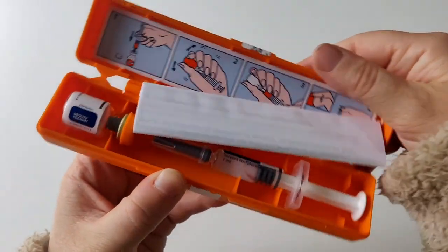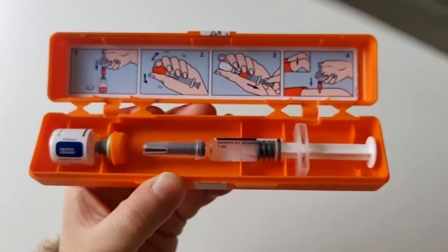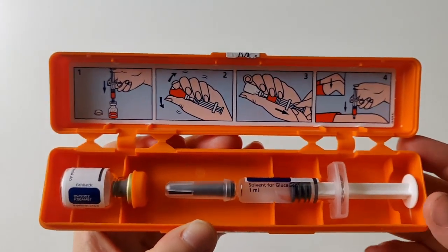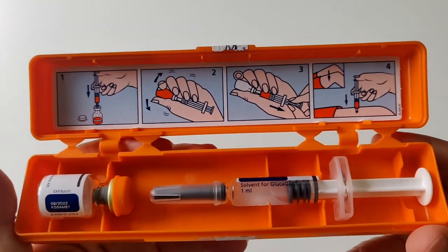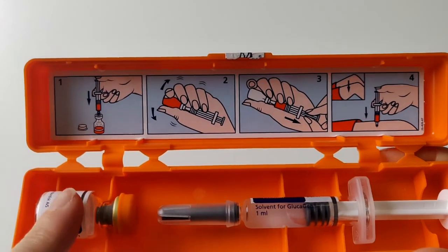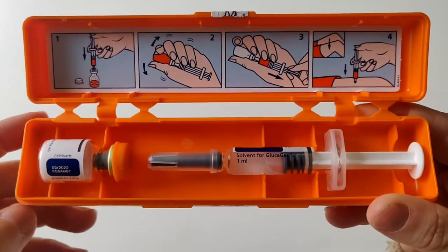Let's open it up — this is how it looks inside. There's a little leaflet on how to use the kit, and what I find very helpful is that since this will be used in an extreme situation where you might be panicking, there is also a quick picture guide showing how to use the glucagon injection.